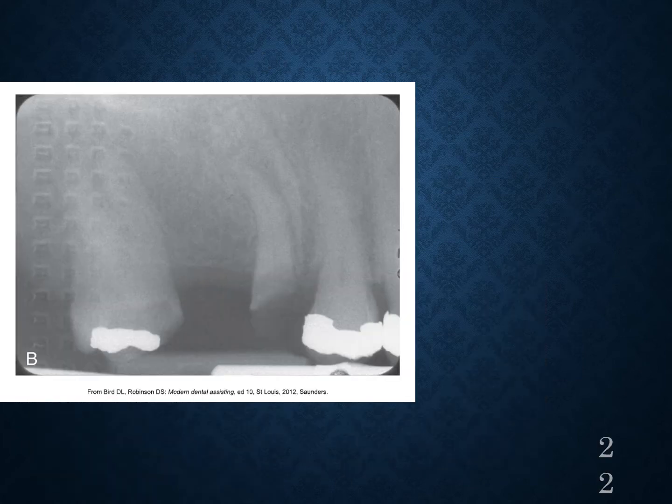So this is an example of what a film would look like if it had been placed in the mouth backwards. Sometimes that word backward can feel a little weird. It's basically what it would look like if the film were flipped over and stuck into the film holder, kind of like backward, but flipped. The image would appear lighter, and in some cases, it used to be called a herringbone pattern. You might find that on late night trivia one night. It would look just like this.